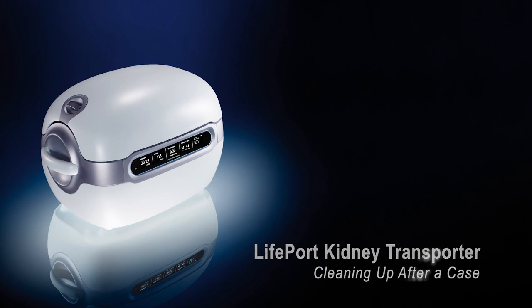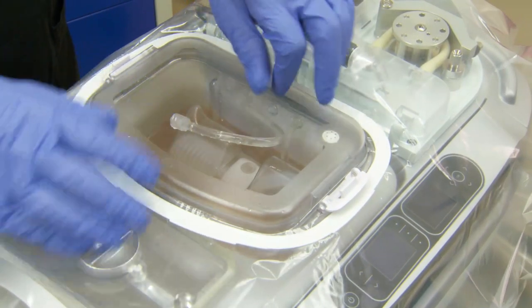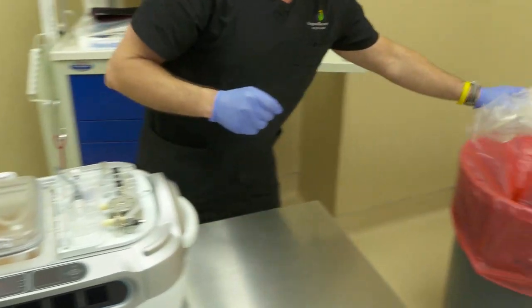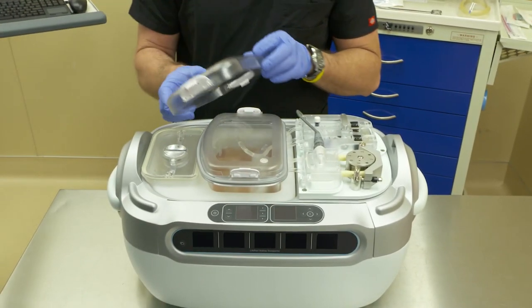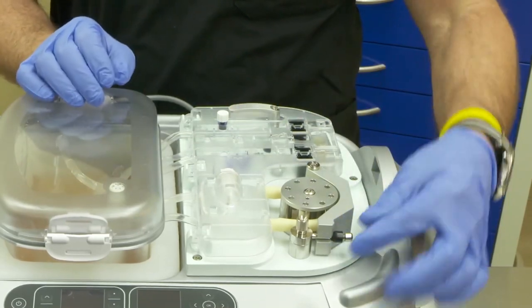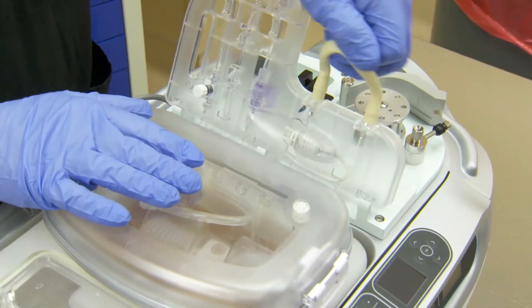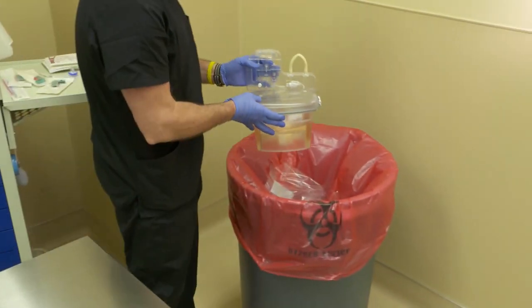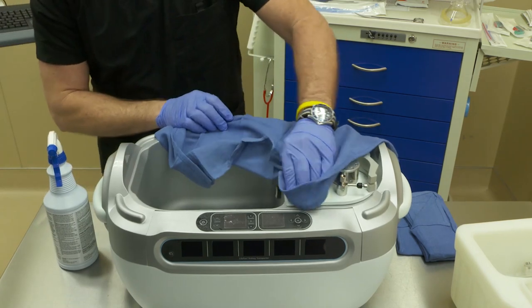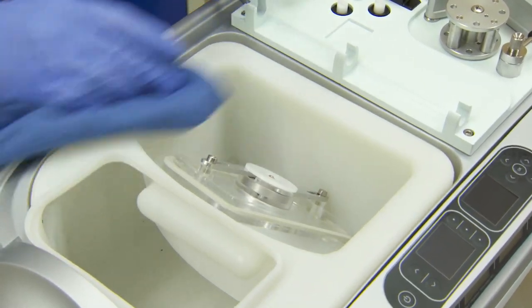Cleaning up after a case. Once the kidney has been removed, power off the Lifeport. Replace the inner lid on the perfusion circuit. Remove the sterile drape and dispose of it accordingly. Replace the outer lid on the perfusion circuit and remove the perfusion circuit from the Lifeport by disconnecting the pressure sensor, turning the latch, and opening the pump head. Dispose of the perfusion circuit accordingly. Remove and empty the ice container and clean the Lifeport with a 70% isopropanol solution. Replace the ice container and ice container lid.